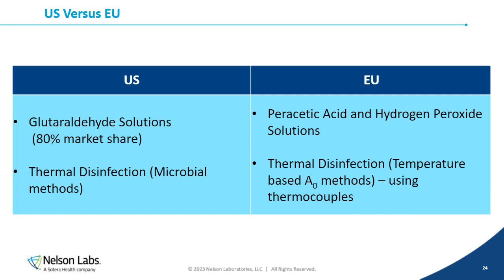It's very difficult to make an equivalency claim between two different disinfectants. Even disinfectants that have the same active ingredient, it is difficult to make equivalency claims. So if you're going to list more than one disinfectant in your IFU, then more than likely you're going to need to show data to support each disinfectant listed, and that disinfectant is able to be properly used on your particular device.